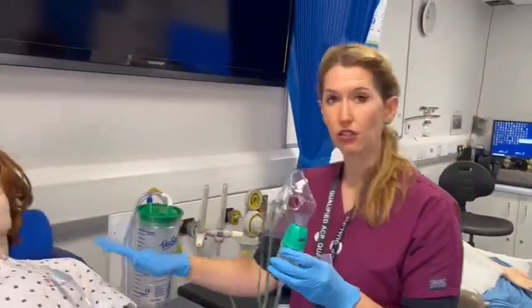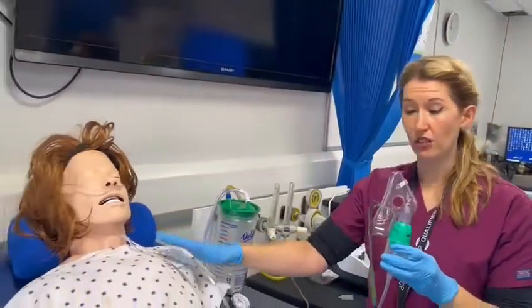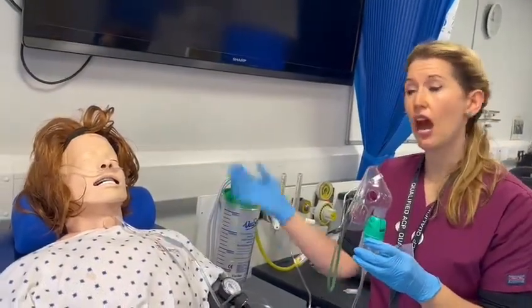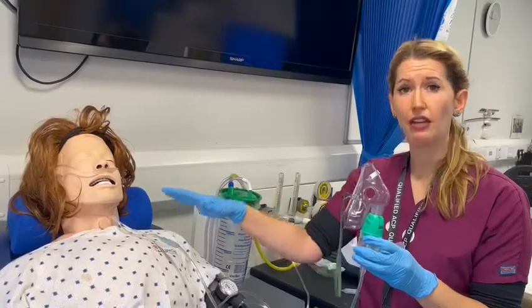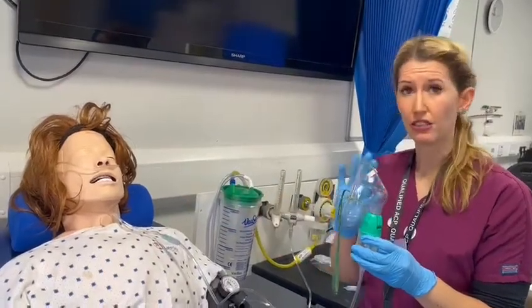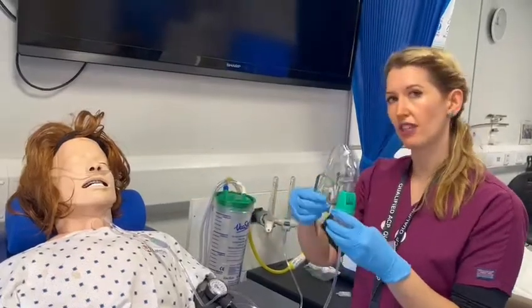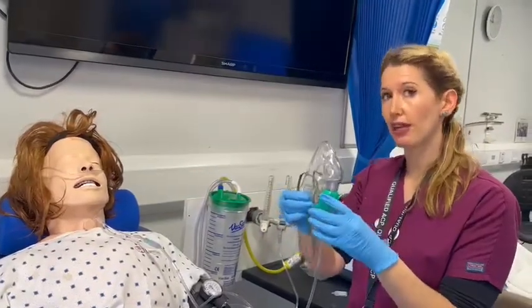My patient still needs oxygen. This patient already has a nasal cannula on, but if they had a venturi mask on I would convert them to nasal cannula first prior to administering the nebuliser, because they still need oxygen rather than actually driving it by oxygen.